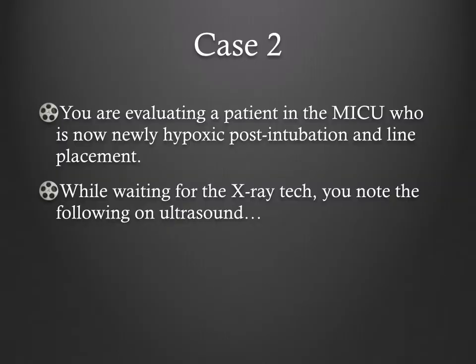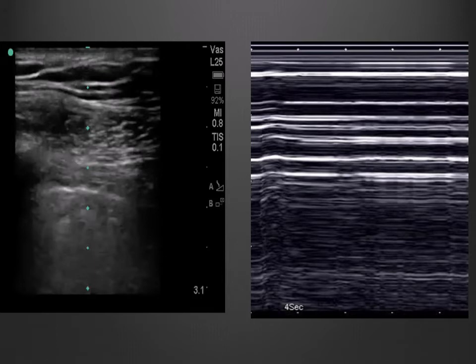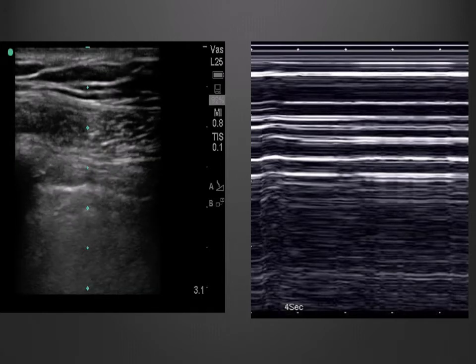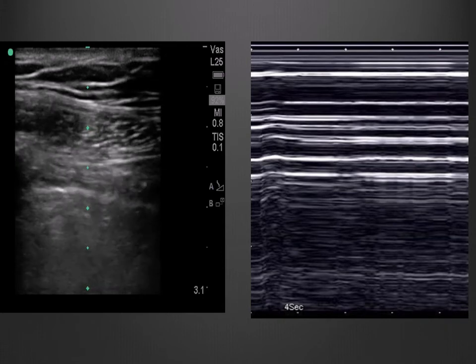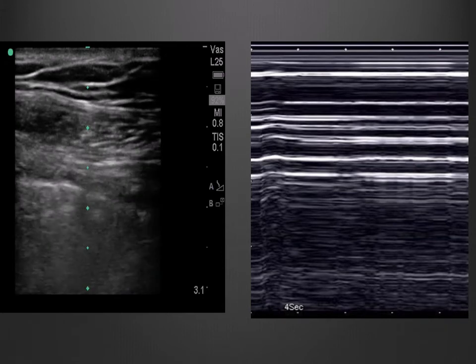Case 2. You are evaluating a patient in the MICU who is now newly hypoxic post-intubation and line placement. While waiting for the x-ray tech, you note the following on ultrasound. Using your linear probe, you notice this patient lacks B-lines and, more importantly, lung sliding. You apply M-mode and note the tell-tale barcode sign with absence of lung pulse. You correctly and immediately diagnose your patient with a pneumothorax.